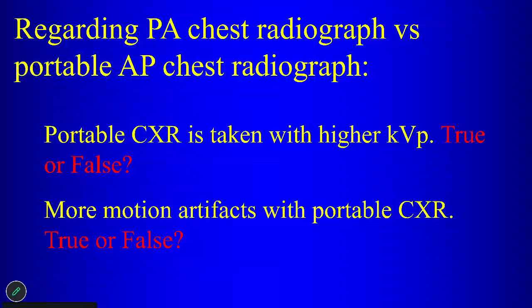Can anybody tell me? They're disoriented or something. That could be, but it has to do with the exposure time, right? The exposure time for a portable unit is longer than the exposure time for a unit in the department. Why is that?